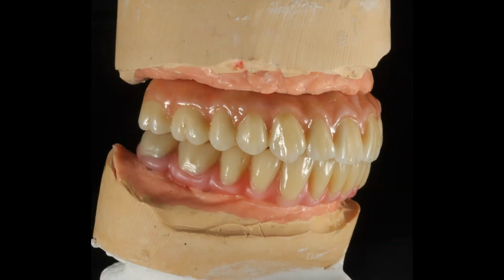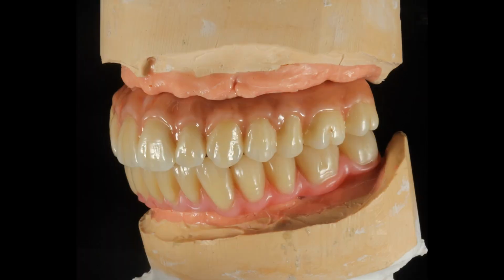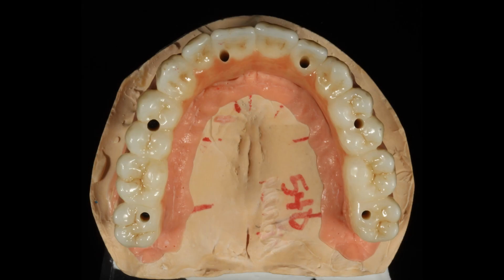This is the right lateral view of the same. This is the left lateral view of the same. This is the occlusal view of the final restoration.